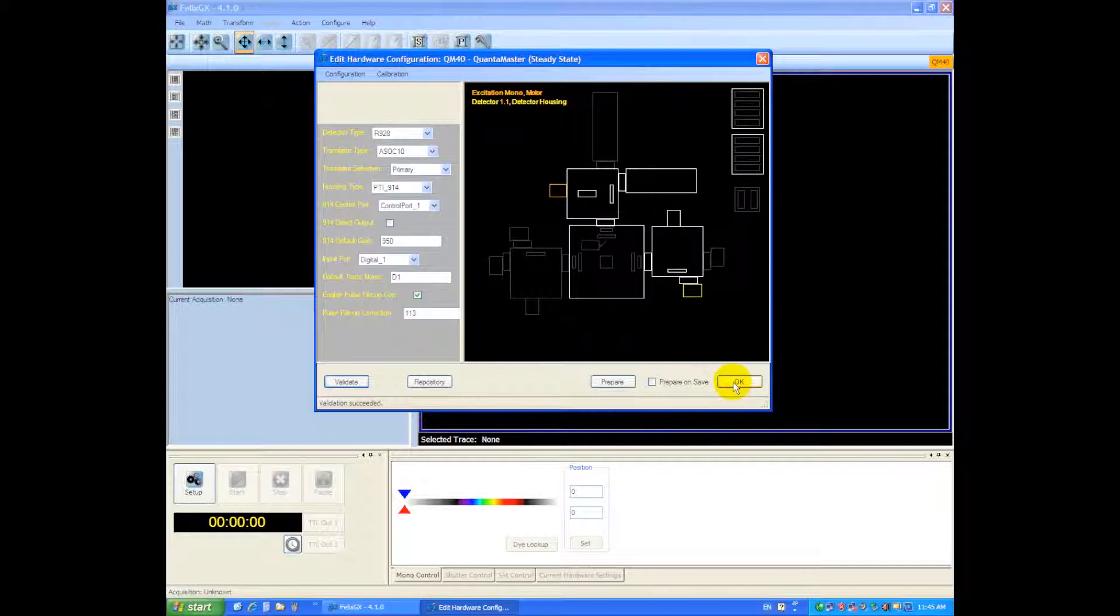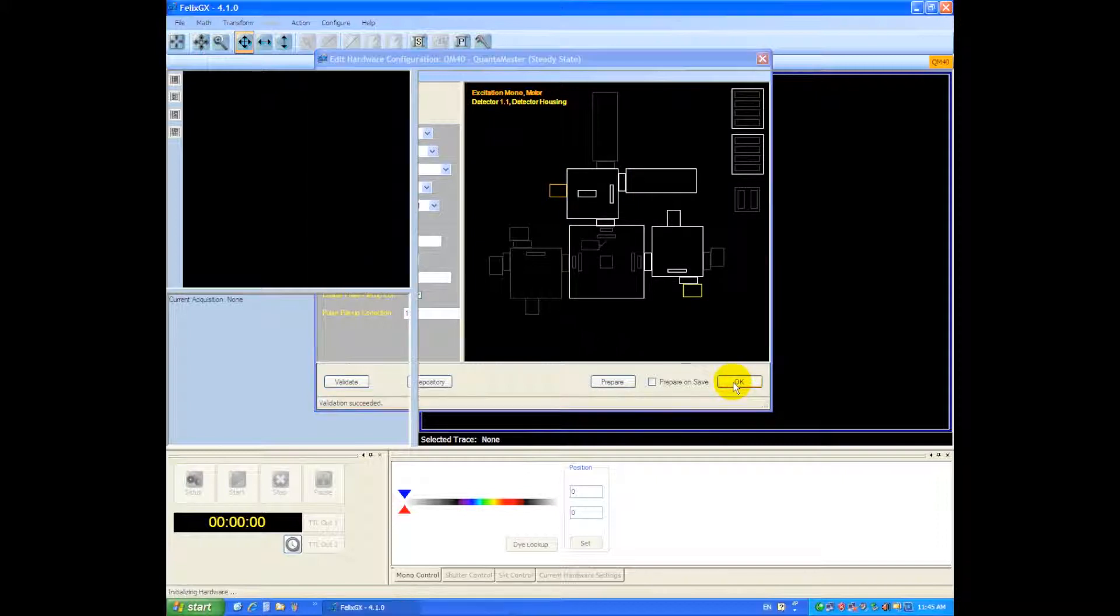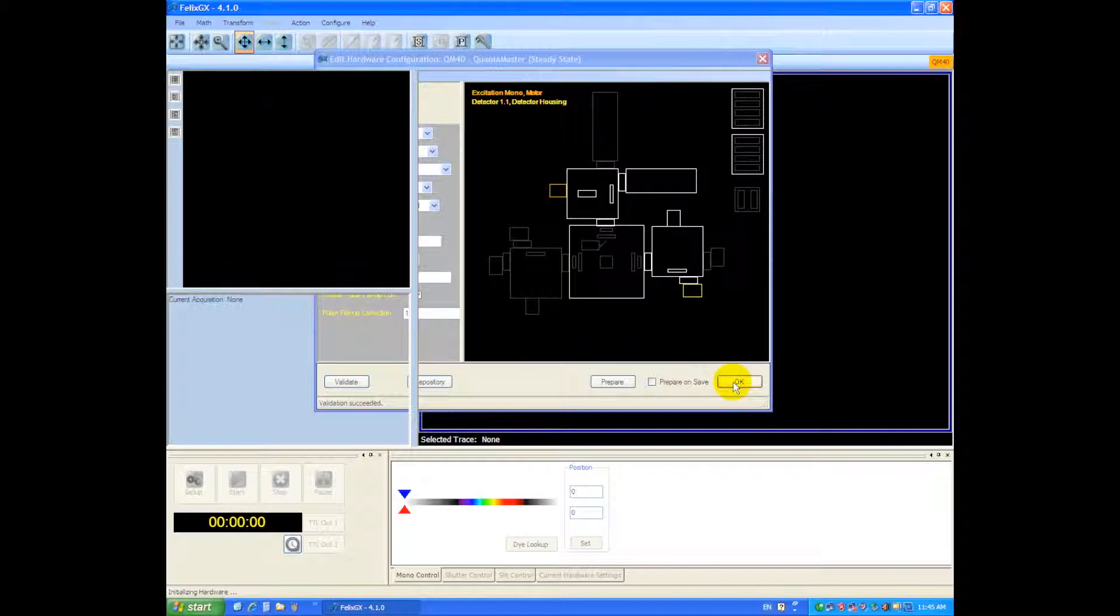Once you've done that you can say OK and close the hardware configuration and then the instrument will begin to initialize the hardware.